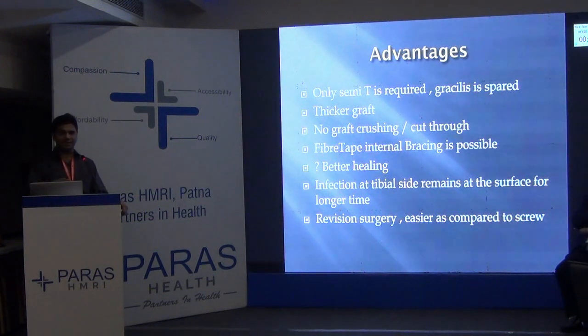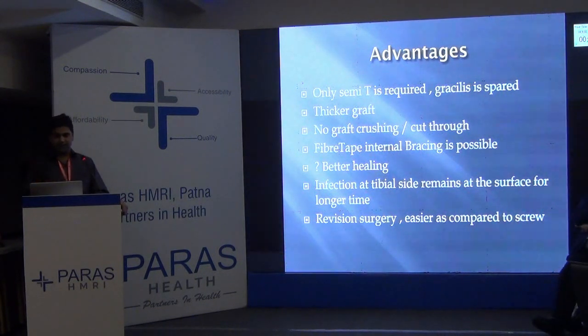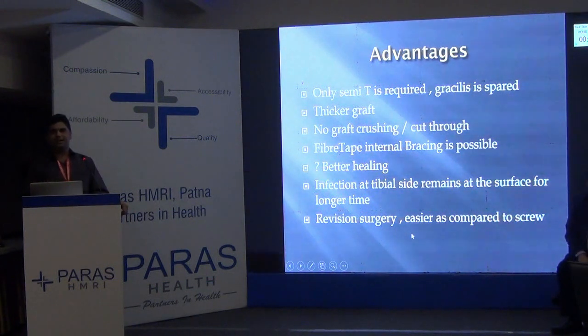The screw is inside, you cannot give lavage under local, you have to open it and the lavage will not reach inside the tunnel. But this is sitting over the tibial surface, so you can give lavage if at all your knee is infected. And the best part is, if you are revising a suture disc, then believe me, the revision of the tibial side is as good as the primary surgery, because you will find bone formed just beneath the suture disc, and you can just remove it and do a tibial drilling like a primary surgery in suture disc.